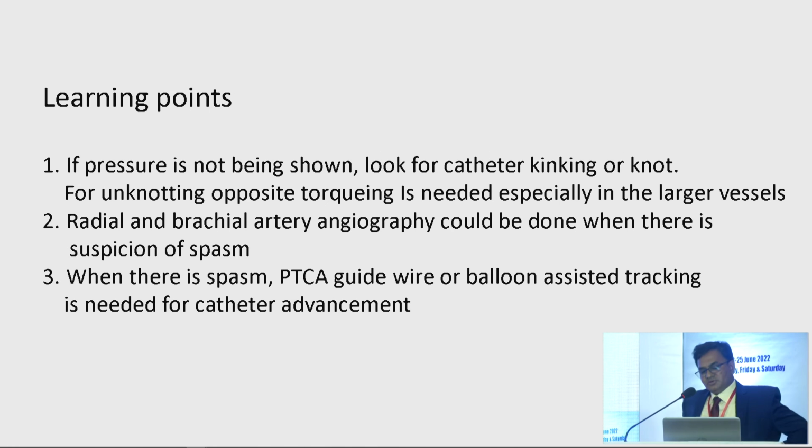So, Mr. Chairperson, I am just about ending my presentation. What are the learning points from these cases? While doing coronary angiogram, if pressure is not being shown, look for catheter kinking. For unknotting the catheter knot, opposite torquing is needed, especially in the larger vessels.